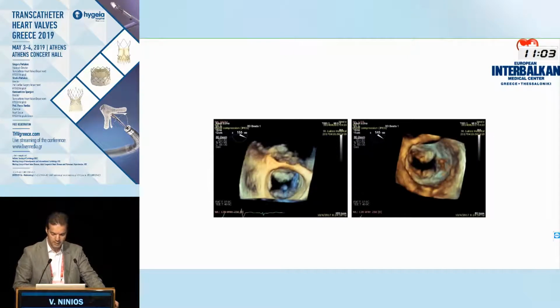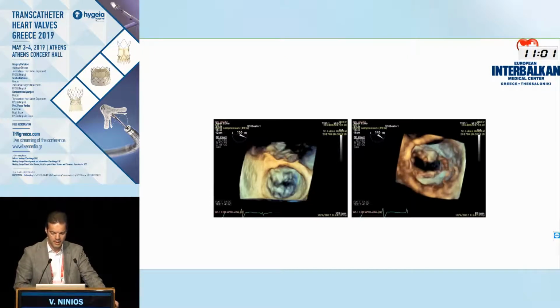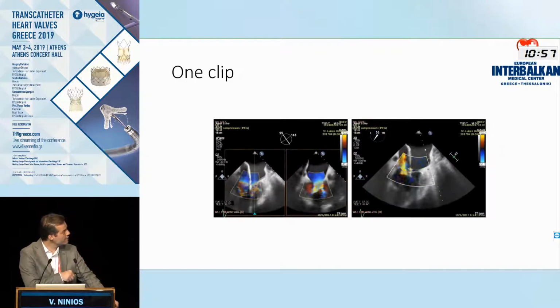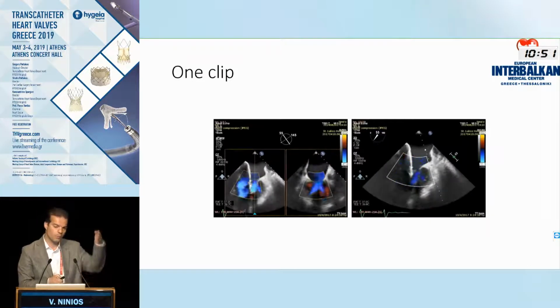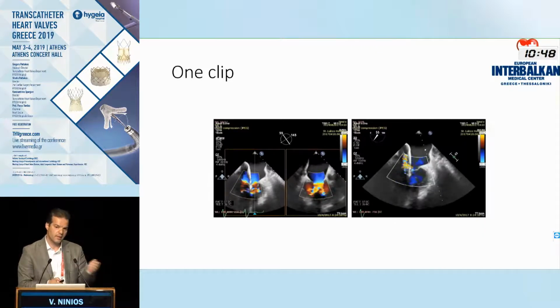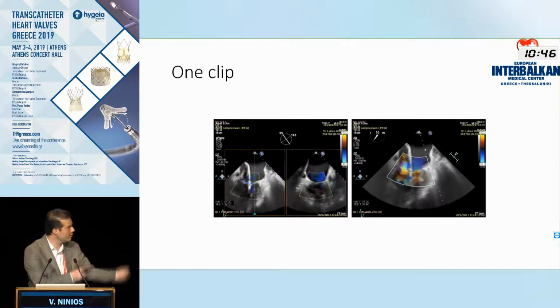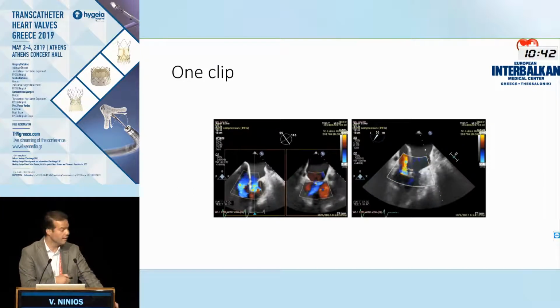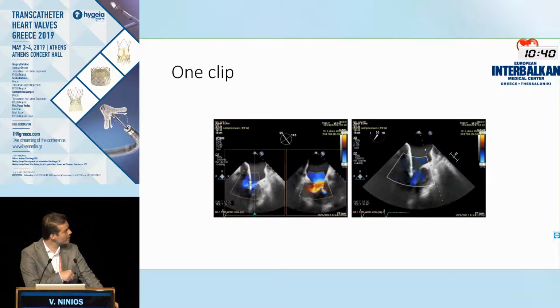So this is the 3D. You can see that the leaflets are not touching each other. This is the first clip. Our intention is always to put the first clip medial and then work ourselves from medial to lateral because it's intuitively easier. You put one clip closer to the septum and then your second clip goes beyond it and beyond. But sometimes you cannot grasp medially, so you grasp where you can. And this is lateral. So the first clip is lateral.